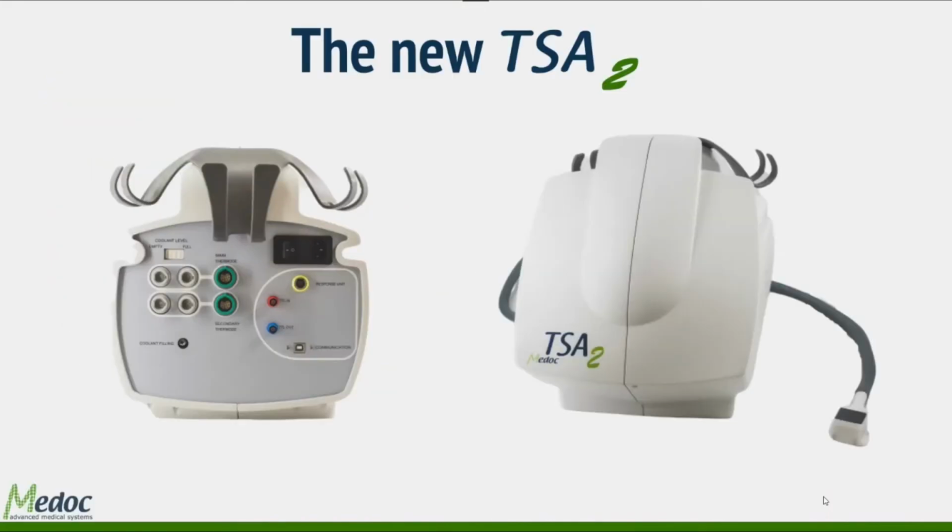So let's start by looking at the device. Here you can see the picture of the back panel and front panel of it. But just for the sake of understanding the dimensions of the device, I would like to show it to you. I will turn my computer now and show you the device. You can see that it is a tabletop device, not very big, portable, has its handle, it can be taken around, has the thermode sitting on it, and I will show the thermode closer now to the camera. So really just to show you how the device looks in real life. And now back to me.